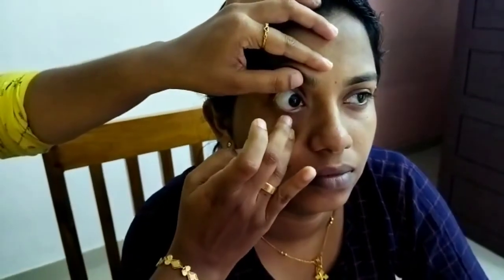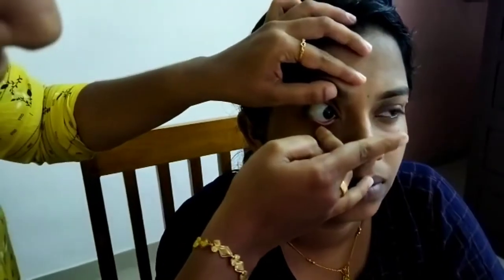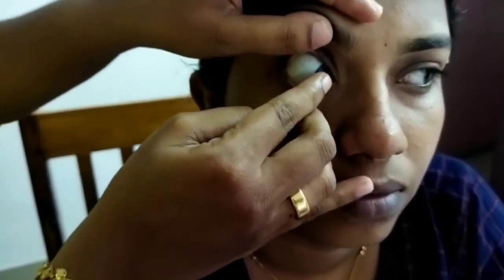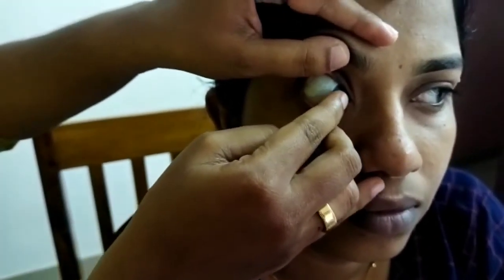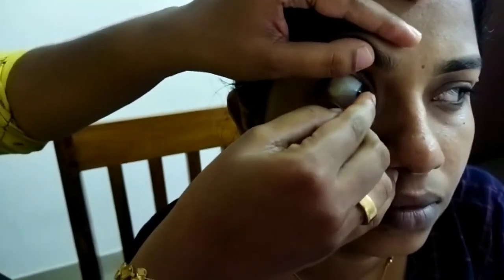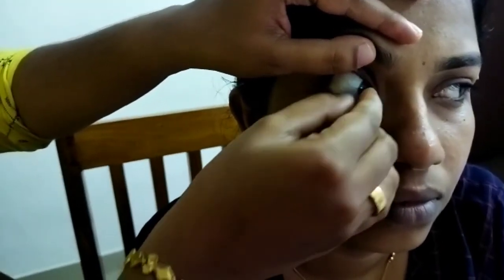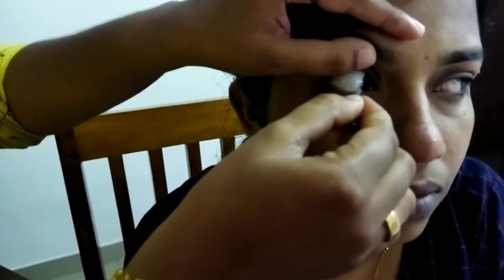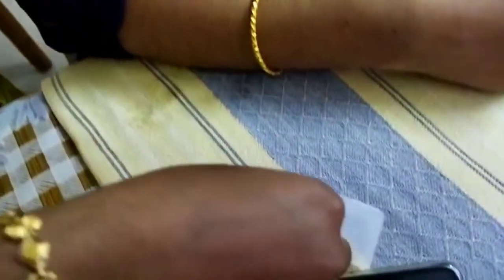The last step is removal. Hold the upper lid, pull down the lower lid, and ask the patient to look up. Slide the lens down with the forefinger of the right hand, then pinch out the lens with the thumb and finger. Then place it in the blister pack. Thank you very much for watching.